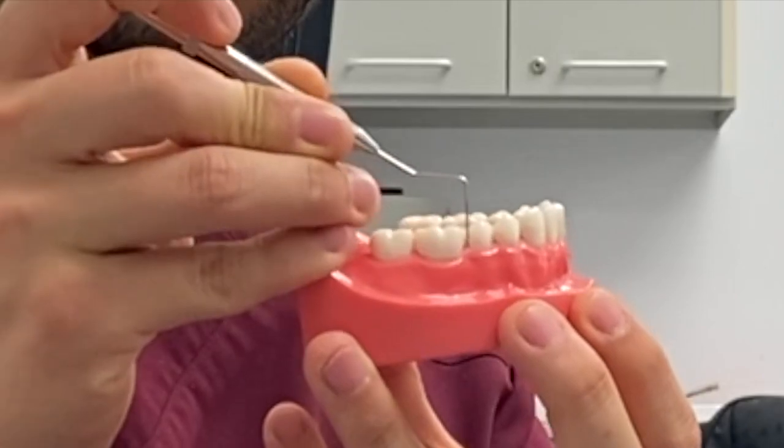The first step is that we're going to have to do a breakthrough through the interproximal. You want to use a flame burr or a 169L for that. The second step is going to be the occlusal reduction. We'll want to reduce that, then followed by the axial reduction. We're going to go around it, then do the finish line and refine the prep. We're going to go through each of these in more detail as we do this video.